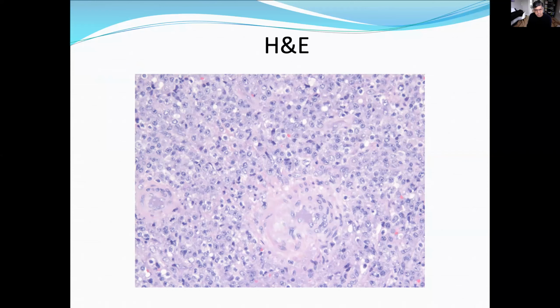The big question first is hematopoietic or not? Yeah, that's the first question everybody has to ask. Just because I'm a hematopathologist and showing you this case doesn't mean this has to be a hemopath-related case. So keep that in mind too.